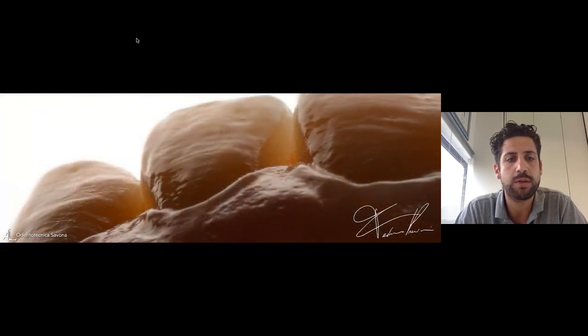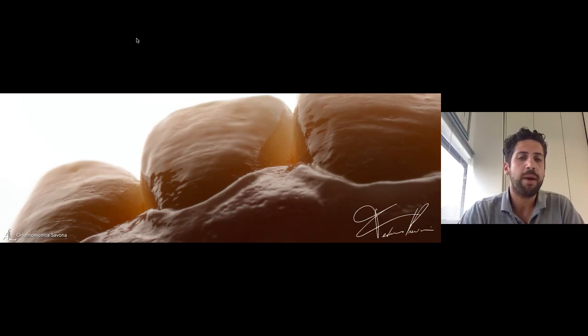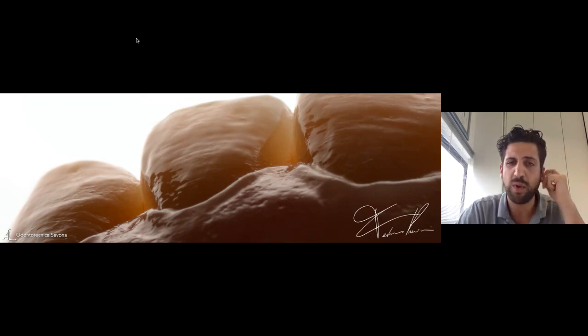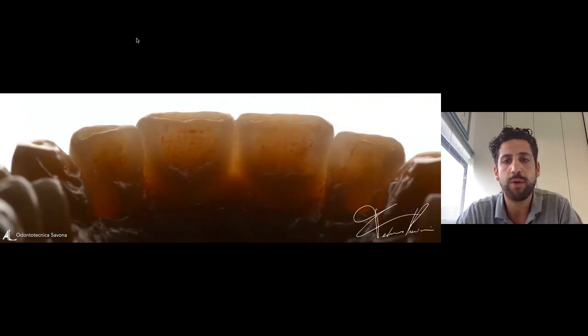Some more pictures. Closer, you can also see the texture. If you remember the structure, the green stage of the white zirconia was really rough, really aggressive, but after the glaze and also after the polishing by hand, it's much smoother. Compare with the light.